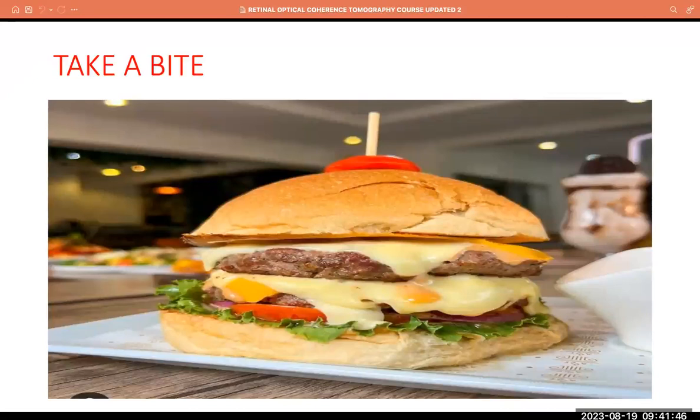The center should be the toothpick above the tomato here. So these other layers are layers of the retina if you put everything together. It will cut from up, down, and from left to right. And the image that meets the toothpick on each side will be depicted as a macula. So this, next slide.